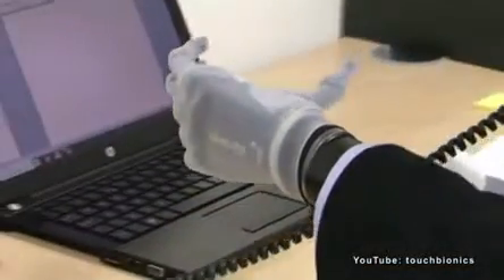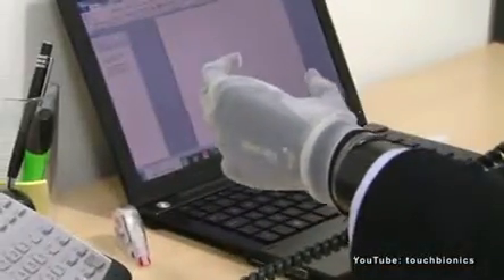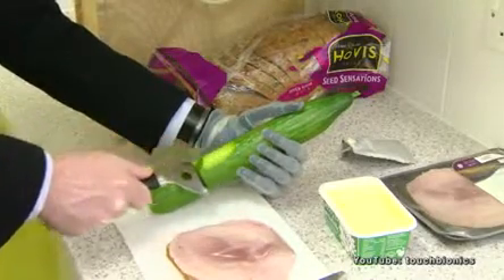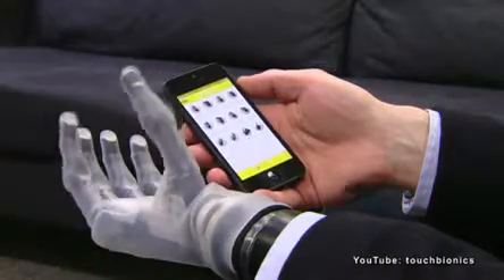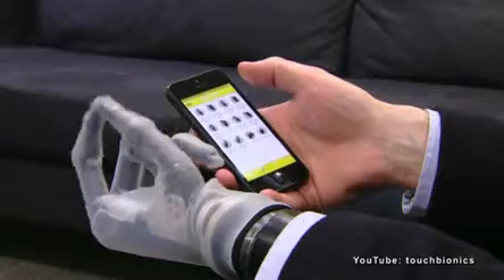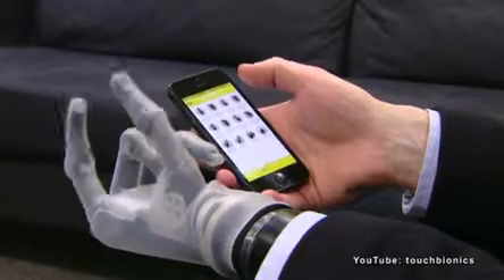The ease of use — not only in terms of controlling it with the muscle signals, but also the app that not only allows you to configure the different parts of the hand, but also to activate certain custom grip modes on the spot.